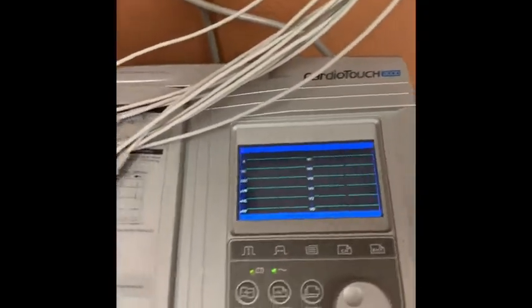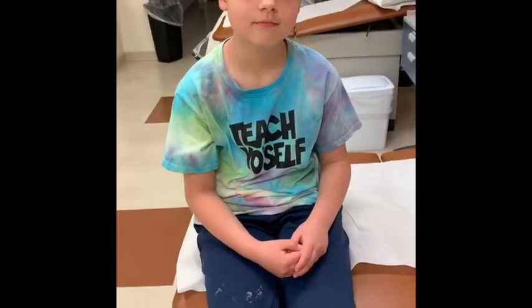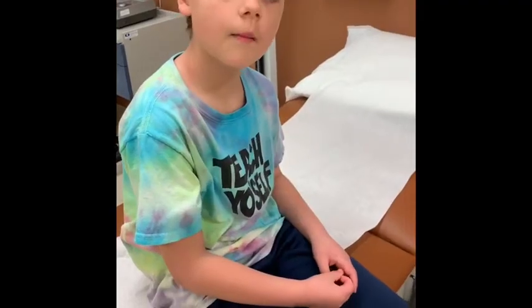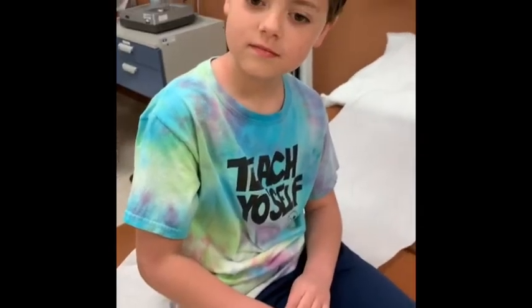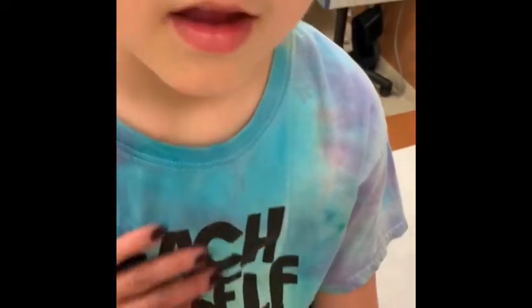So now I'm going to go ahead and get my patient ready for the EKG. Today we are going to be doing an EKG. Have you ever had an EKG done before? Yes I have. Do you have any questions for me? The EKG — what we're going to do is put 10 stickers on your body. Two on your upper arms and one on each arm by your deltoid. Then we're going to do one on each leg on the inside of your calf. And then we're going to put six right across your chest.